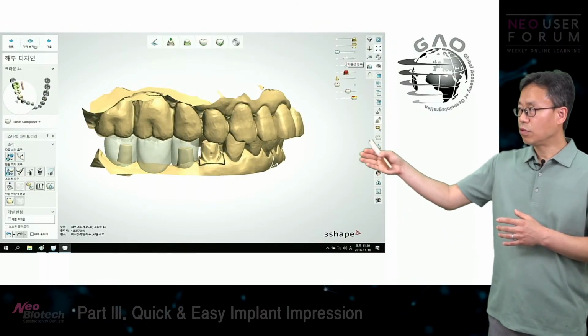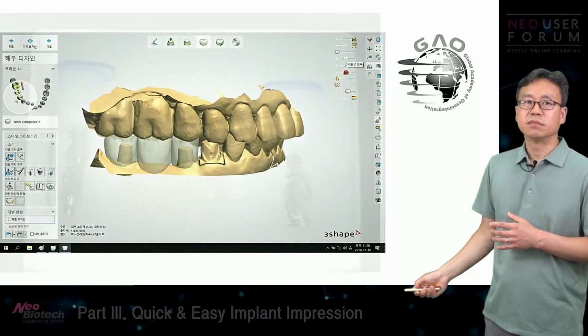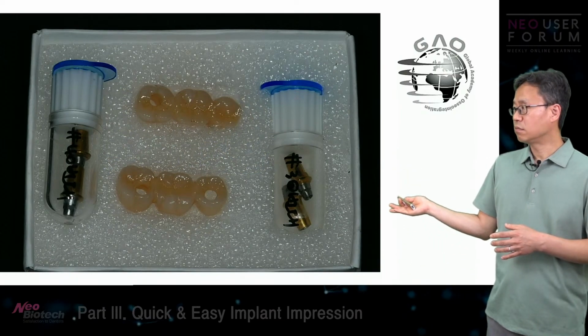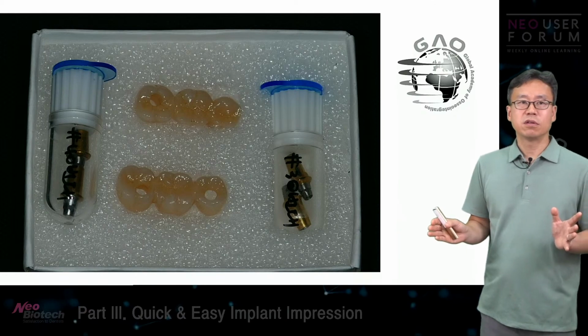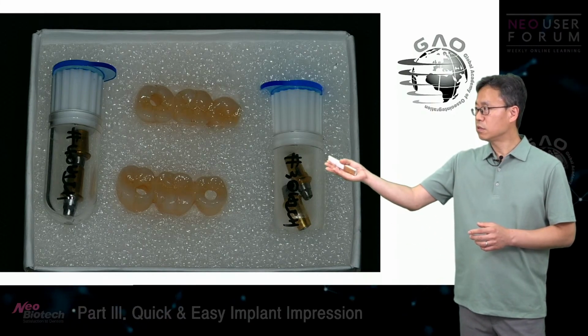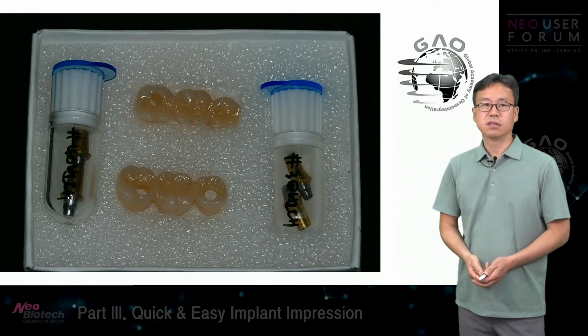You can see through the abutment design through the full wax-up. And what you will get from the lab is this: no model or whatsoever, just the abutments and zirconia crown.